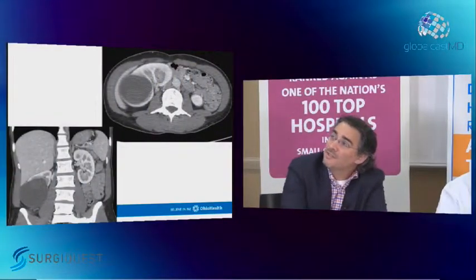Maybe I'm crazy, but I never do biopsies of cystic masses. So what would you do in this case? Nephrectomy, partial nephrectomy? What would be your thought? From that one, I couldn't tell, but up on the top, it looks like you could do a partial on this.